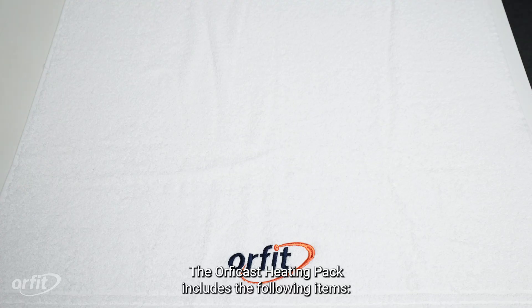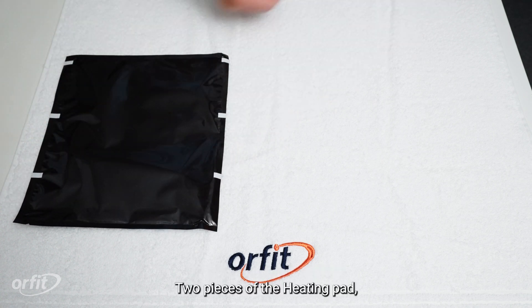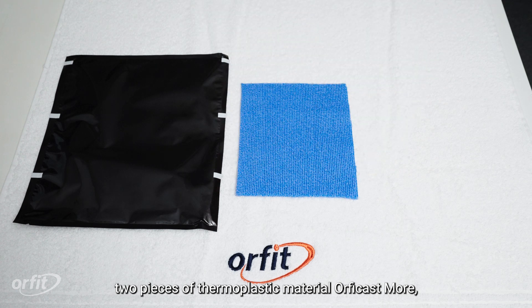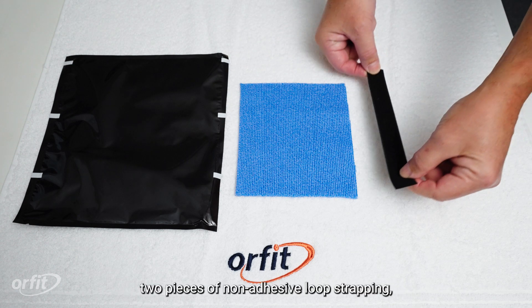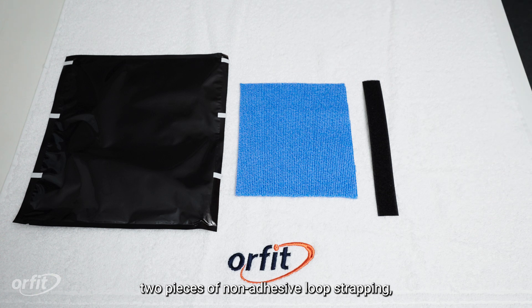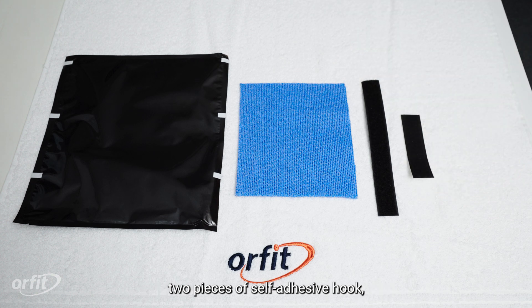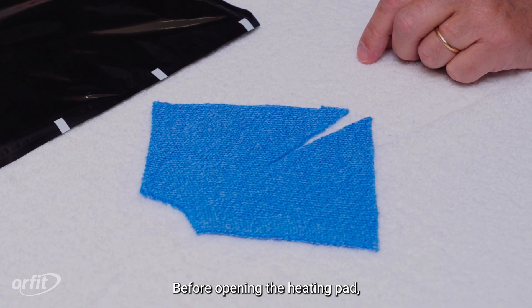The Orficast heating pack includes the following items: two pieces of the heating pad, two pieces of thermoplastic material, Orficast More, two pieces of non-adhesive loop strapping, two pieces of self-adhesive hook, and instructions for use.